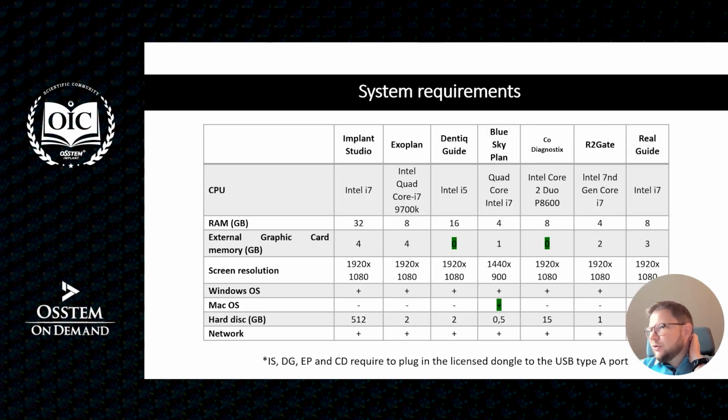Another thing we checked is the system requirements, and this is quite similar. However, only two software support Mac systems, and these are Blue Sky Plan and Real Guide. The others require operating on a PC computer.